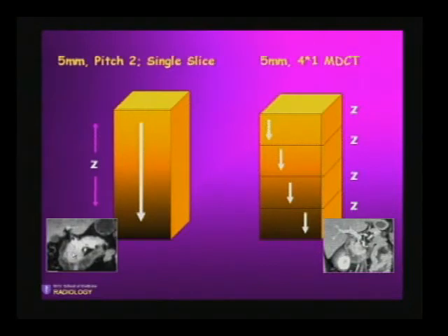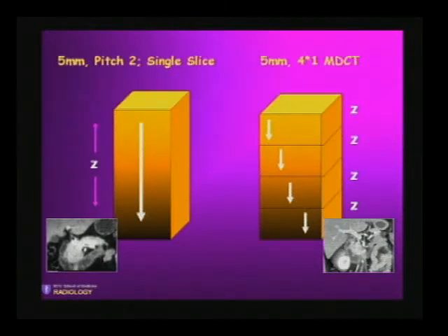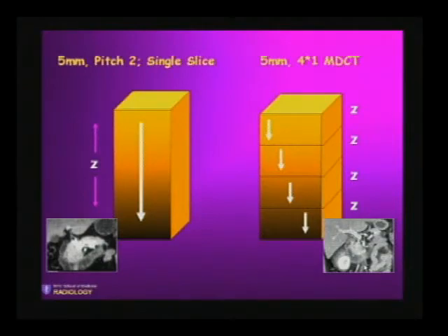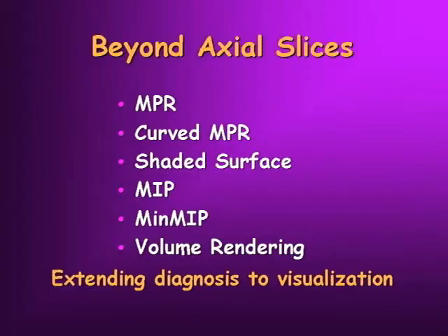If you take the same area with a single-slice scanner — here's the duodenal sweep, the pancreas, the vessels — notice how much sharper it is in the same area with a different patient utilizing multi-detector technology. It's specifically because this image, at the same slice thickness, is composed of multiple isotropic voxels.